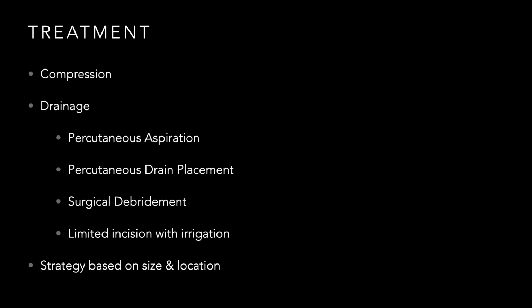So the next question then becomes, well, okay, clinically, I know how to suggest this, right, or be aware of this. We talked a little bit about what we need to do if we find it. So how do I get to making that diagnosis, and specifically what imaging modalities do I need to be thinking about as I'm imaging these patients, right? And given the fact that this is Ultrasound Grand Rounds, ultrasound is going to be a huge component of that, and that's kind of where we're going to end up.